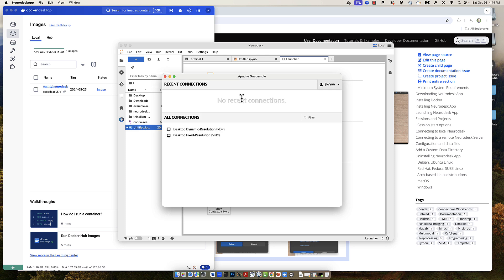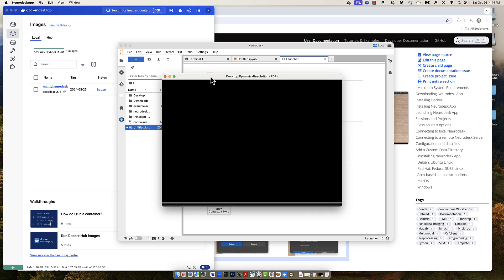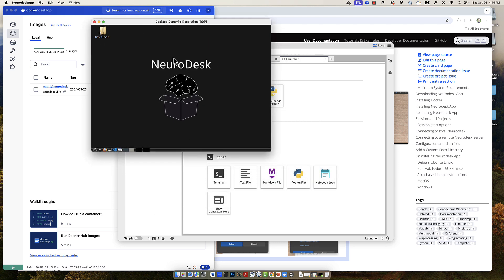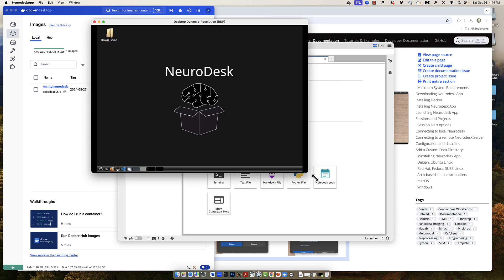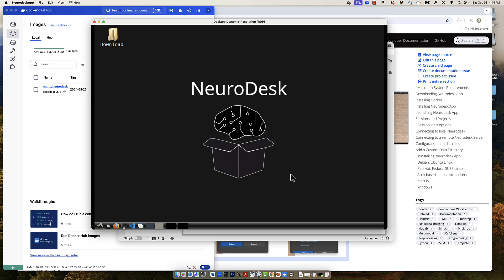I suggest using the desktop dynamic resolution option, since this can be resized to whatever dimensions you prefer. This opens a new virtual desktop which you can use to pre-process and visualize data as though it were on your local machine.